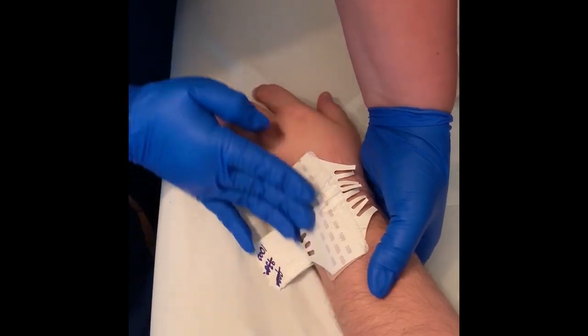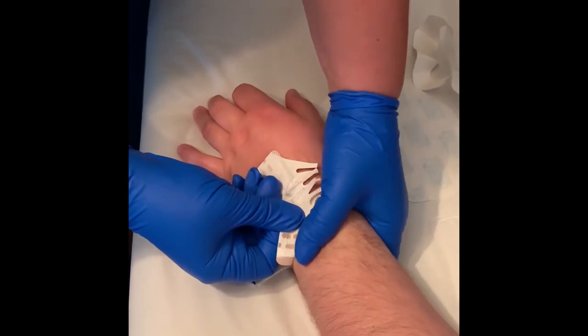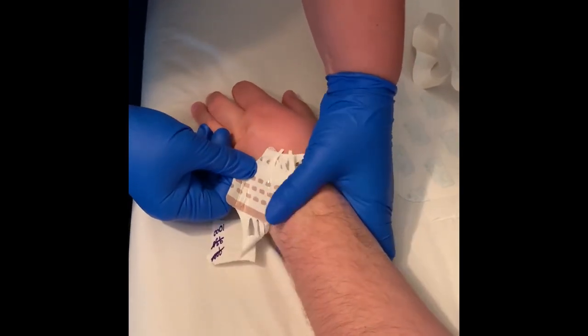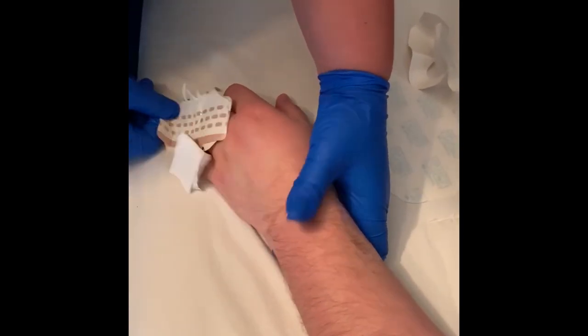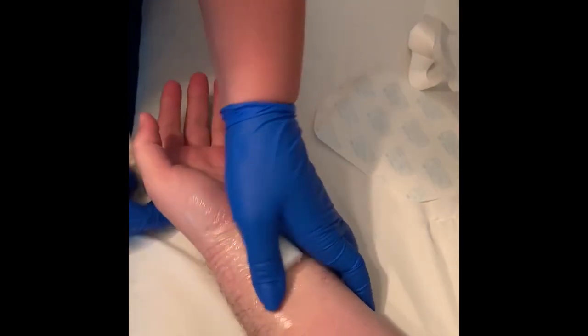Once the Tegaderm and roll are secure, remove the rest of the bandage from the wrist. Direct your patient to leave the roll in place for 24 hours.